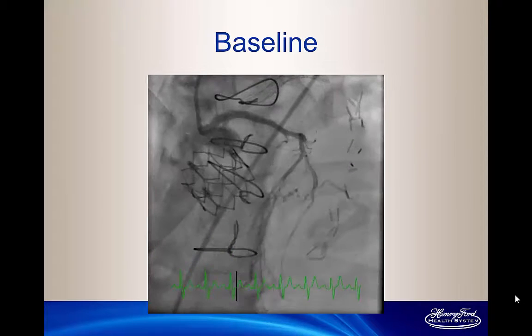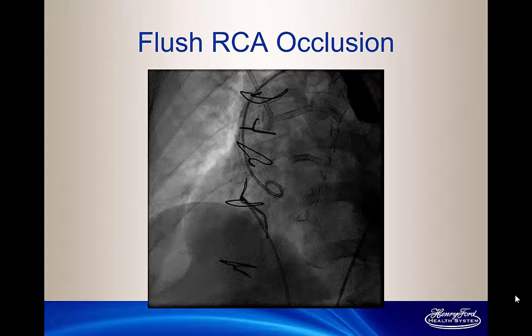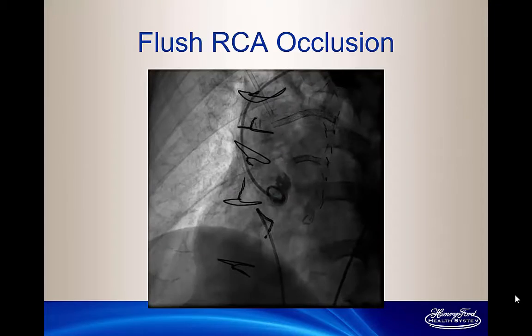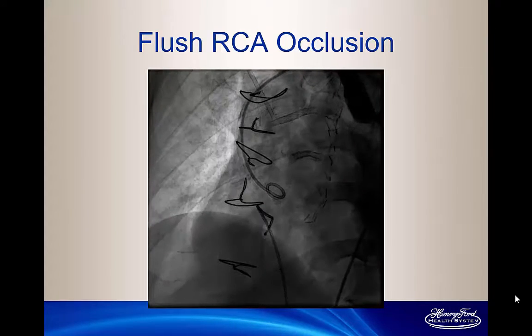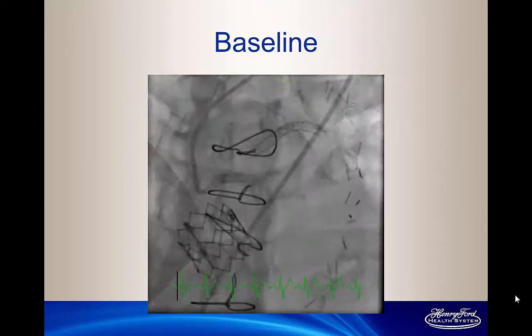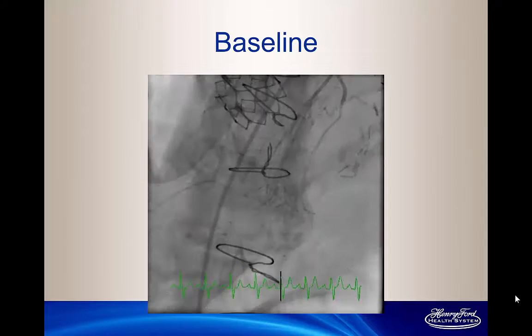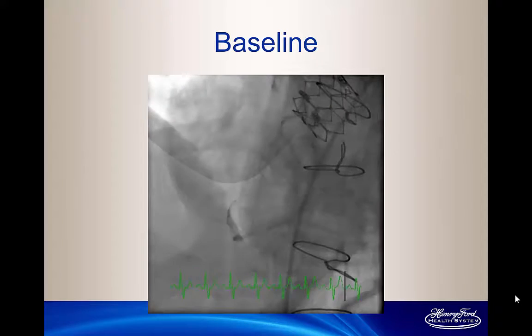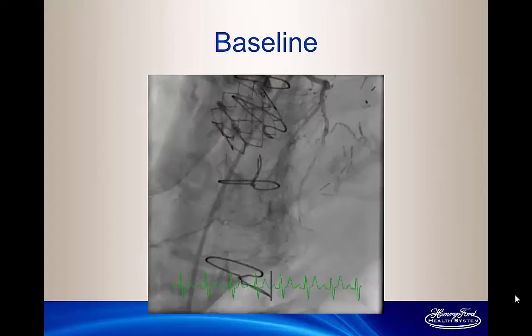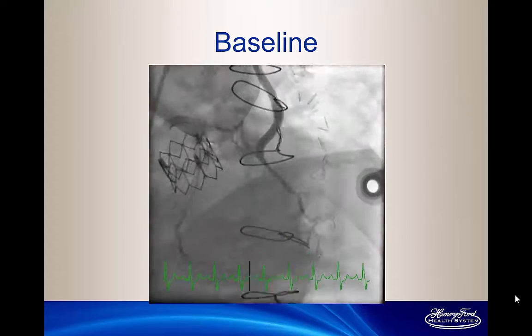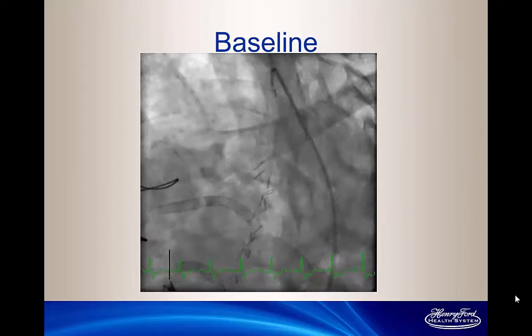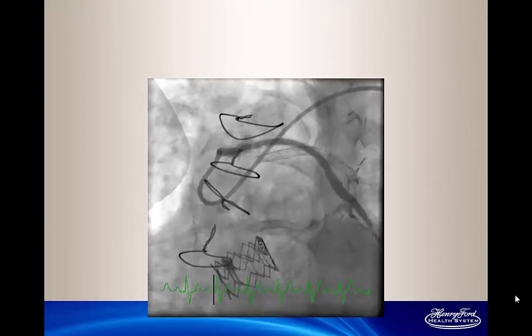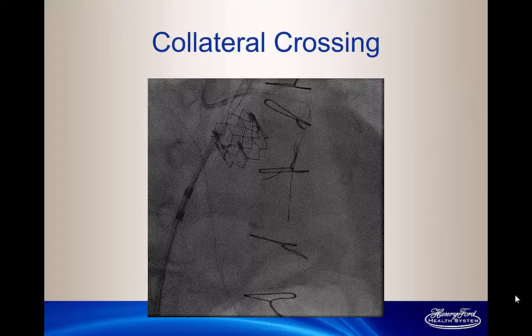This is the RCA angiogram. The aortic root angiogram shows that the RCA is completely occluded, and there is a shadow of a stent there — shadows of stents in SVGs and in the left main. He had a patent left main into a large first septal. The LAD is grafted and the graft is patent. The SVG to the circumflex is providing collaterals to the distal circumflex, and the LIMA shot shows the LAD with not much collaterals to the RCA. The SVG to diagonal also had no collaterals to the RCA.